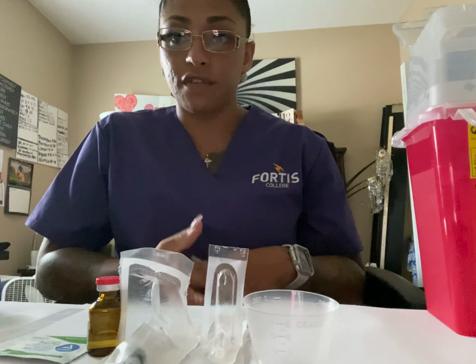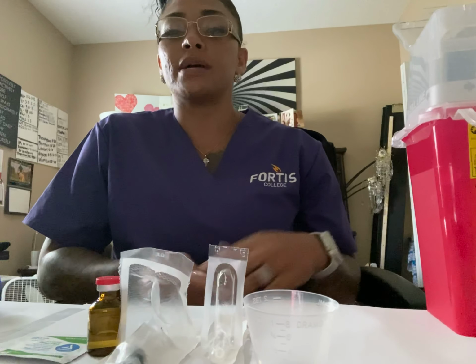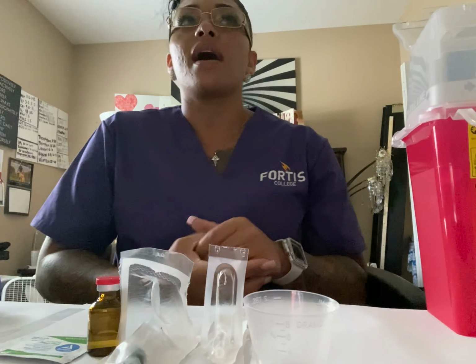After that, I will assess the patient's allergies and make sure that I check the patient for any allergies to the medication. I would have a second nurse verify that the medication is correct. We use 2 patient identifiers, which are the name and the date of birth, and I would look at the barcode to make sure that I'm administering the medication to the correct patient. So I would check the medication vial for the name, dosage strength, the dosage volume, and the route.